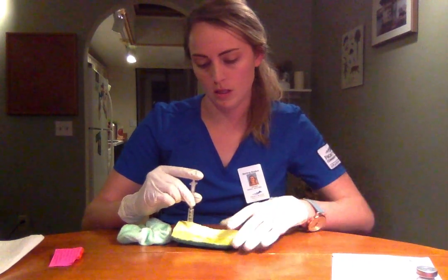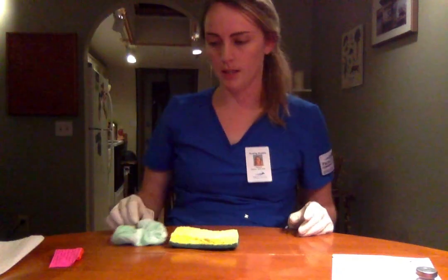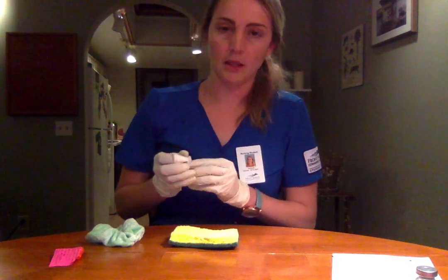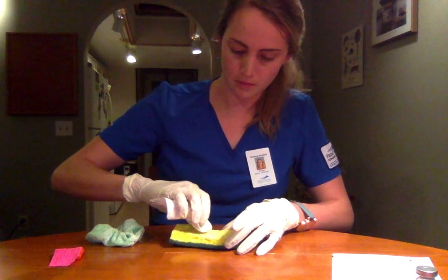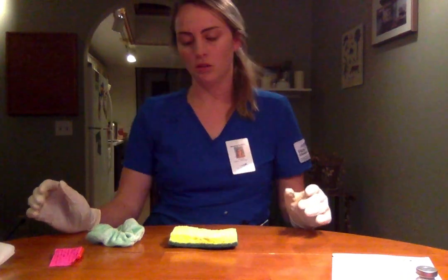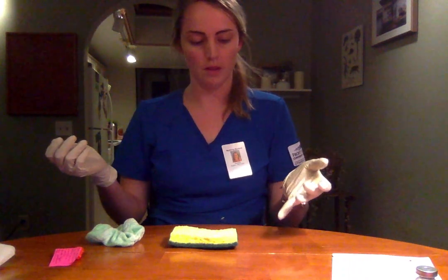Letting go of the bunch and taking out the needle, engaging the safety, and putting it immediately into my sharps container. Alright, Abby, how was that? Oh, it was fine. Alright, I'm just going to dab around lightly any excess fluid. Okay, throw that away. Alright, Abby, so is there anything else I can do for you? No? Alright, I'm going to clean up. So here's your call light button. Press that if you need anything.